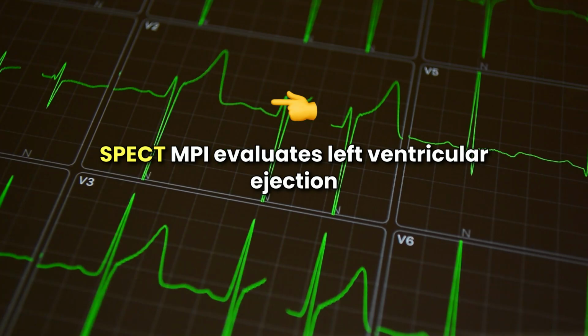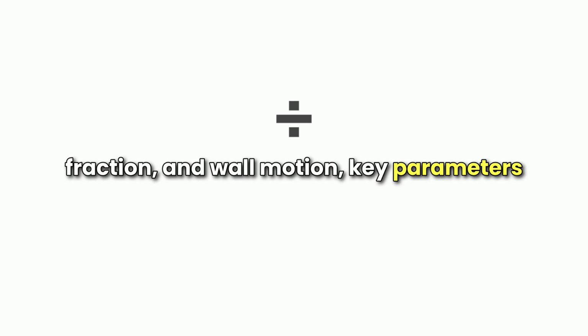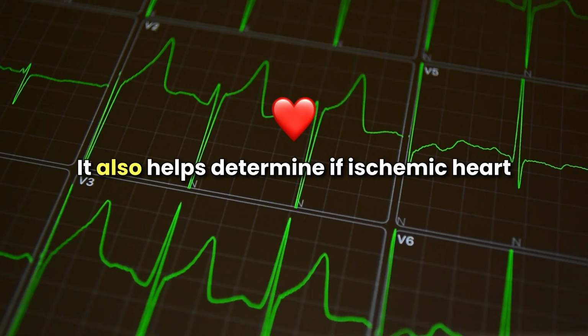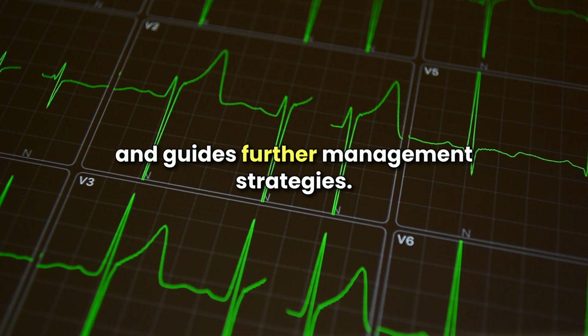SPECT MPI evaluates left ventricular ejection fraction and wall motion, key parameters in assessing overall cardiac function. It also helps determine if ischemic heart disease is the cause of heart failure and guides further management strategies.